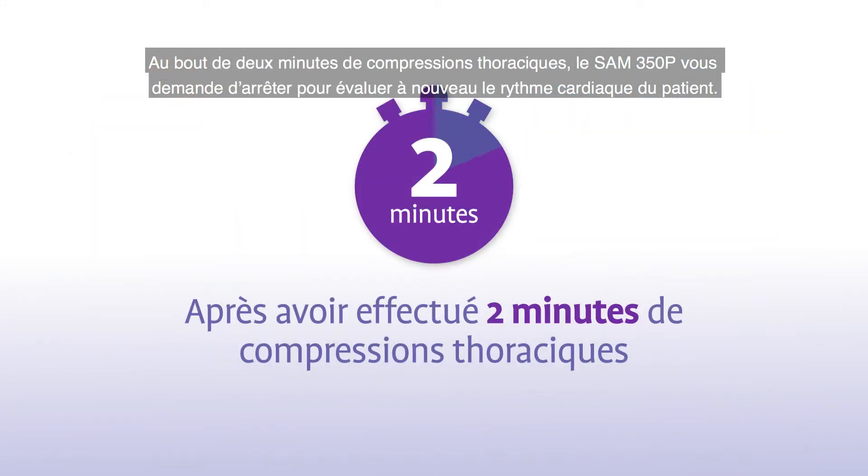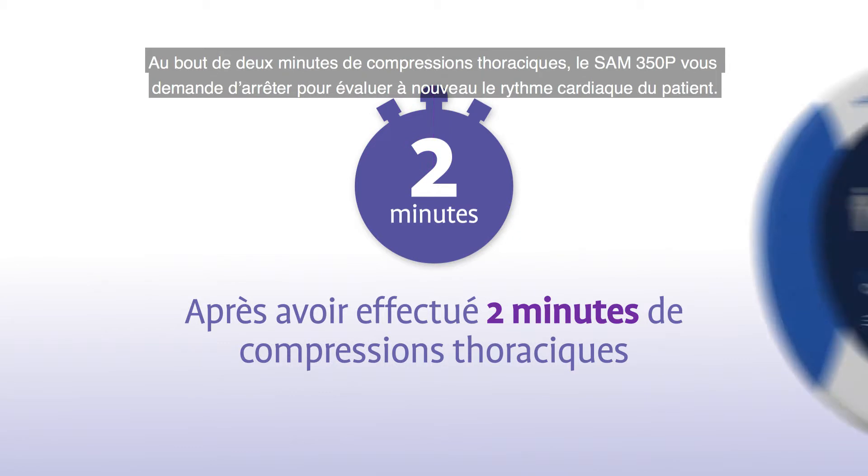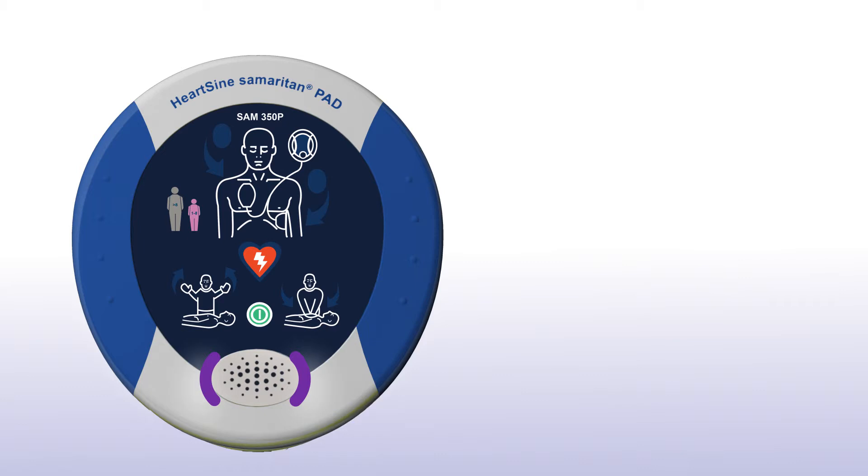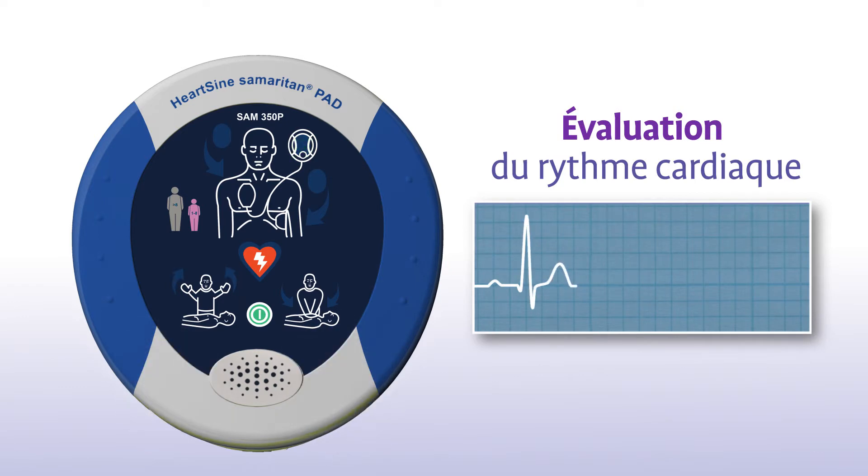Once you have completed two minutes of chest compressions, the Sam 350P will prompt you to stop chest compressions and again assess the patient's heart rhythm. Stop CPR. Analysing heart rhythm. Do not touch the patient.